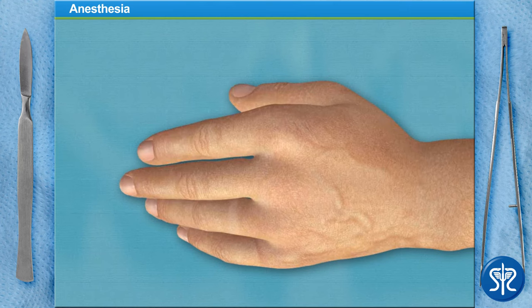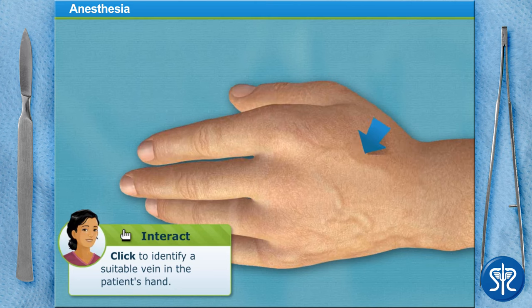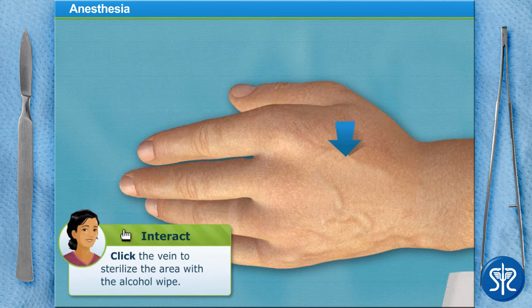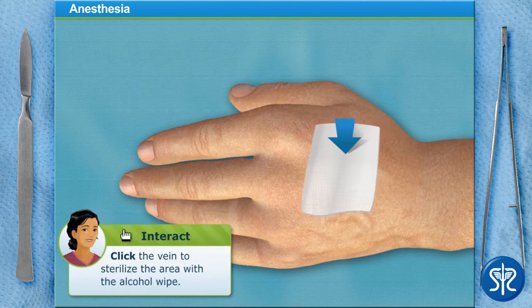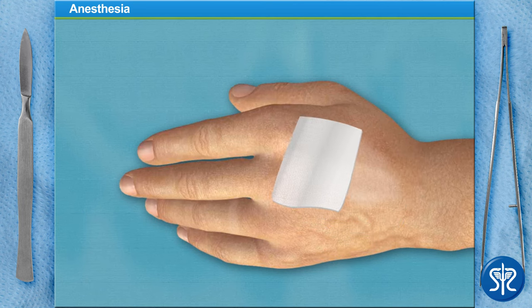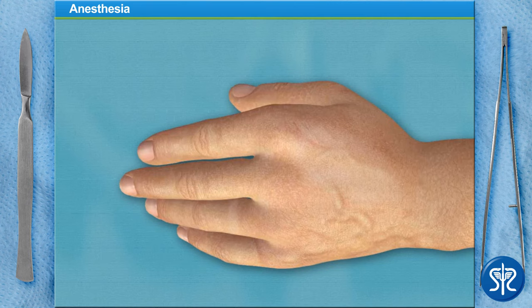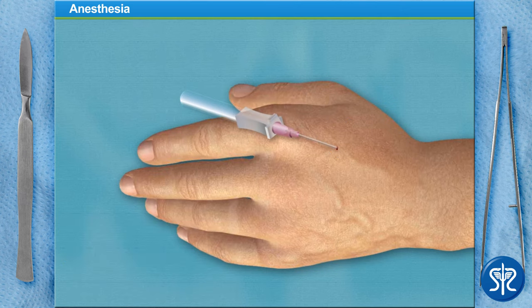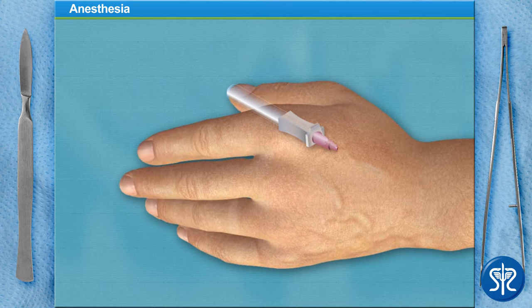We'll need to use a general anesthetic for our patient. Can you find a suitable vein in the patient's hand? Sterilize the injection area using a sterile alcohol wipe. Insert the needle and advance the angiocatheter into the vein. The small burst of blood in the angiocatheter hub is what medical professionals refer to as a flashback. This lets us know that the angiocatheter is correctly positioned in the patient's vein.